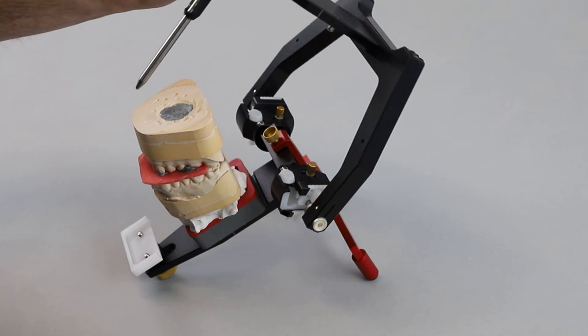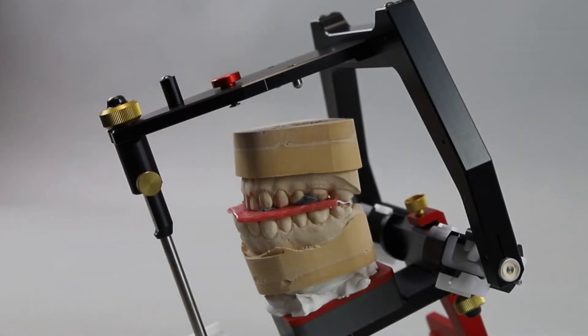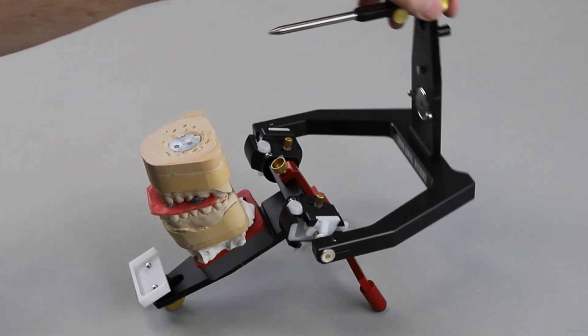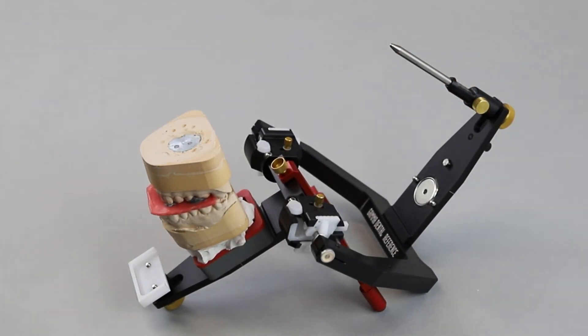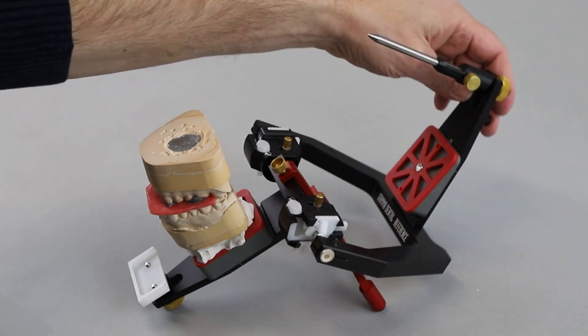Select the distance block for the lower jaw equally as for the upper jaw. Open the articulator and insert the distance block with a previously attached mounting plate. The selected distance block is inserted in the articulator.